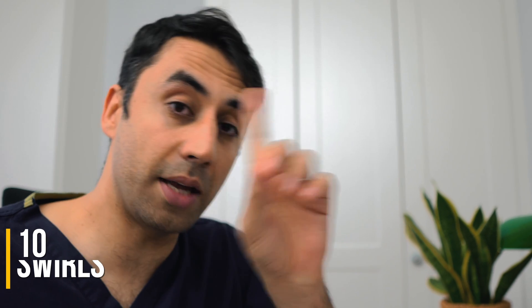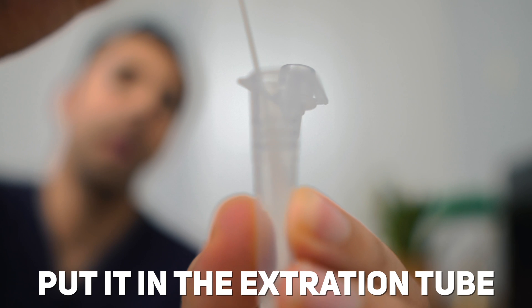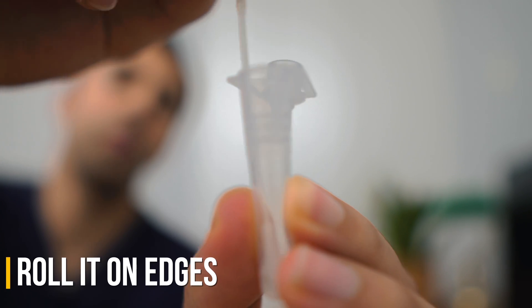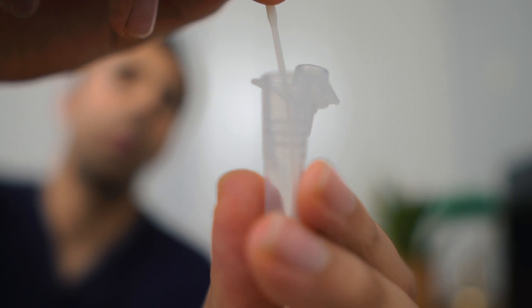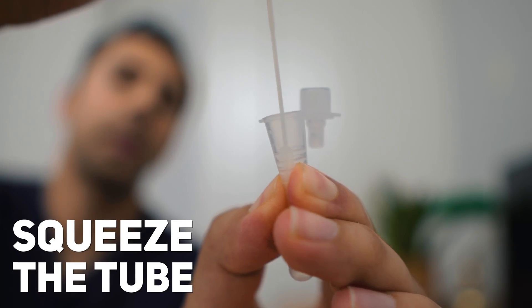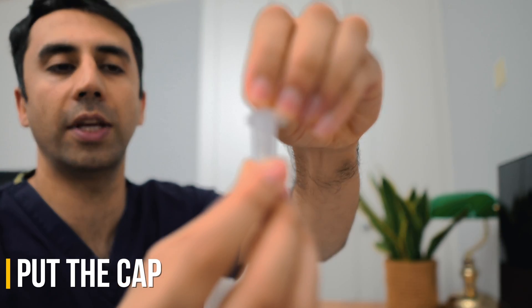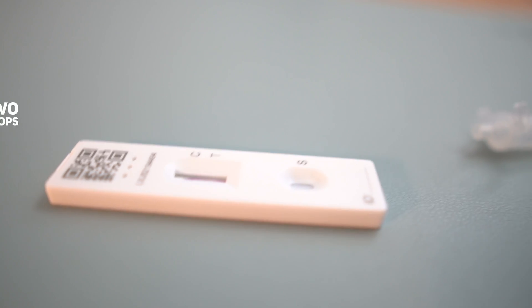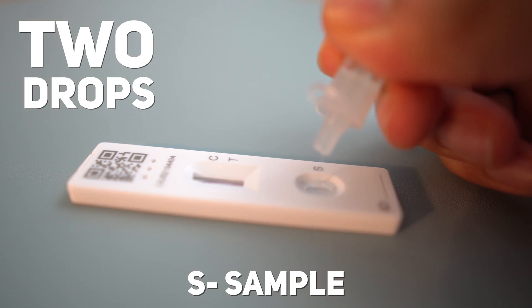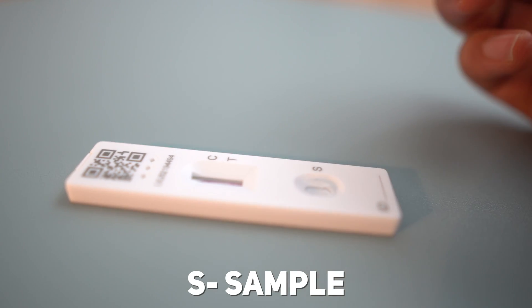Once you've completed the nasal swab, place the fabric end of the swab into the extraction tube. Make sure it's in the liquid, then vigorously roll it around the edges of the tube for 15 seconds. When you take it out, squeeze the tube so all of the liquid is squeezed back in. Put the swab into the waste bag provided, then cap the tube very carefully so you don't spill any liquid. Squeeze the tube gently to get two drops and place them on the area marked S — S is for the sample area. Make sure actual liquid drops come out and not air bubbles.